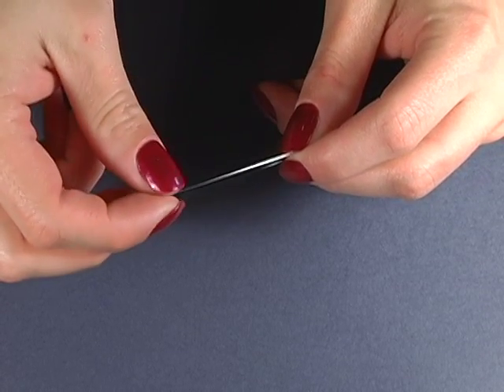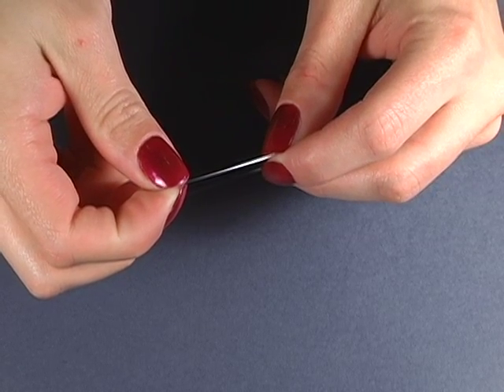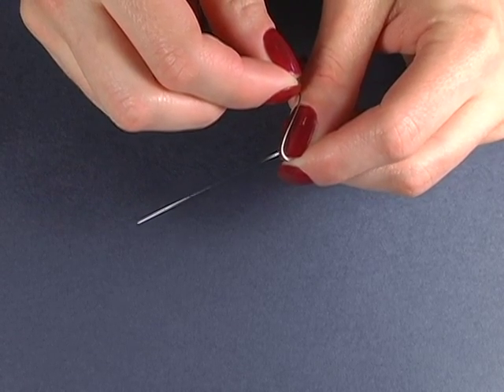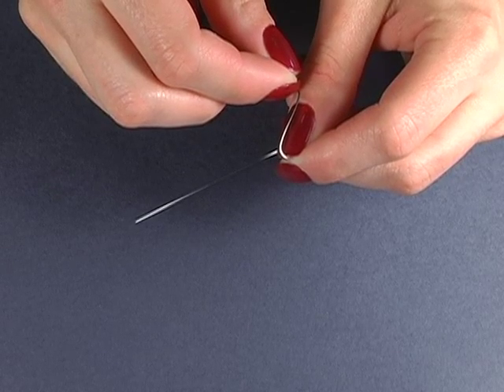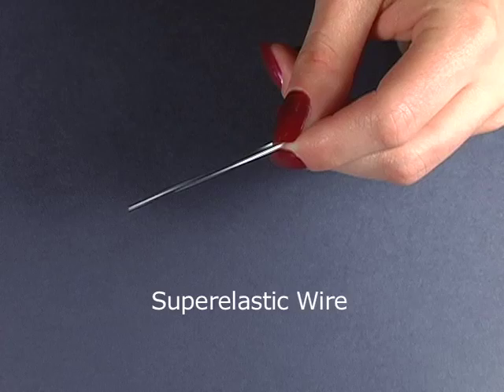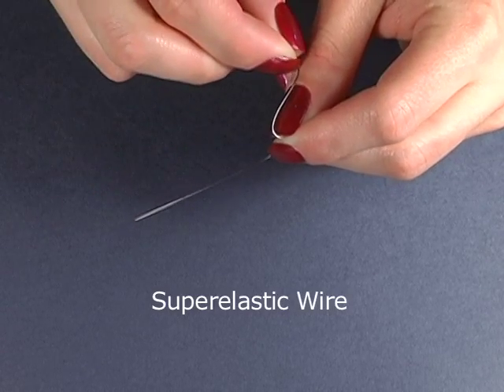Grasp a section of nickel titanium wire between your forefingers and thumbs about an inch or so apart. Now, flex the wire between the nails of your thumb and forefinger of opposite hands so as to form the shape of a Z. You do not want to crease the wire, just gently bend it into the Z. Then release with one hand. This wire is a super elastic force wire. It is resilient to permanent set, springing back fairly quickly to shape without the addition of heat.